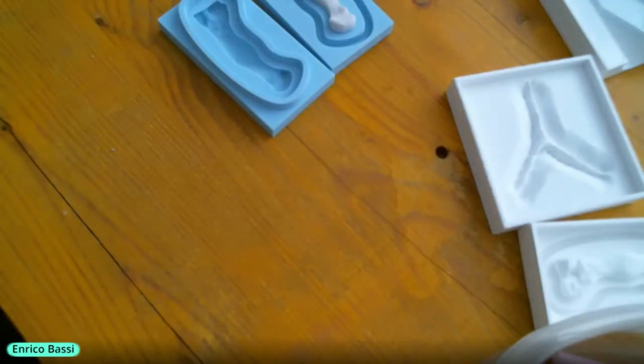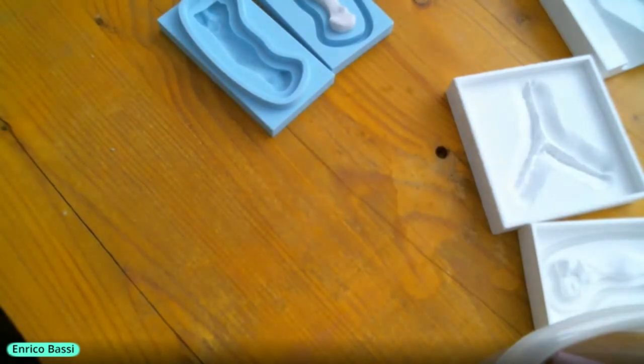Why, after we begin, do we return to Mesh Mixer to join the bone with the part? Why don't we do that in Fusion or SolidWorks? Well, in SolidWorks you can do that. It's managing meshes better than Fusion. With Fusion, you have trouble doing operations with meshes directly. You can do some parts, but it's not the best. Okay, thanks.